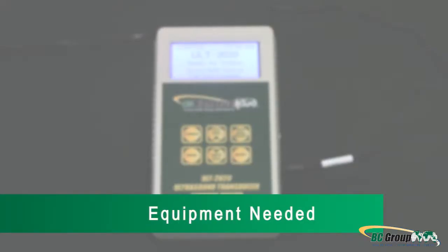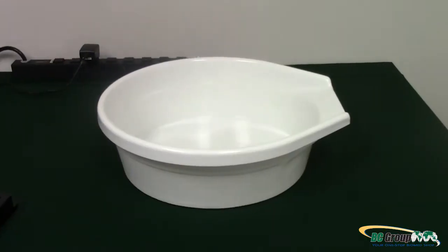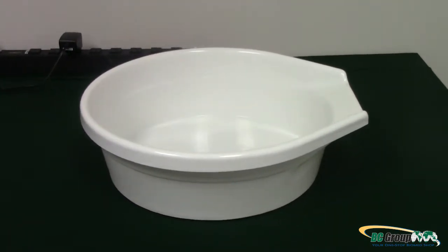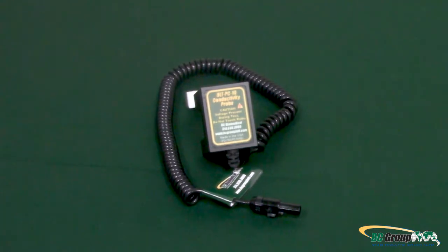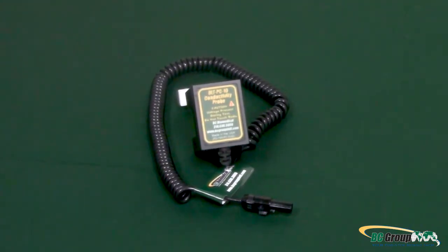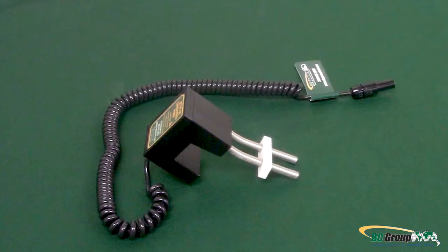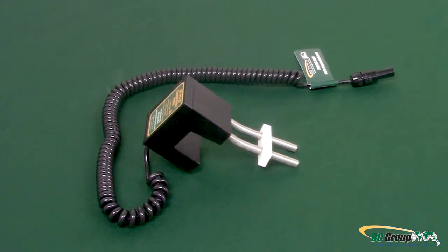Equipment needed to perform the Ultrasound Leakage Test: ULT 2010 or ULT 2020 Ultrasound Leakage Tester — for this demonstration, we will be using the ULT 2020. Soak Tray, Tube, or TD100 — for this demonstration, we will be using a Soak Tray. ULT PC10 for Soak Tray, ULT PC30 for Soak Tube, or ULT PC31 for the TD100 — for this demonstration, we will be using the ULT PC10 Dual Conductivity Probe.